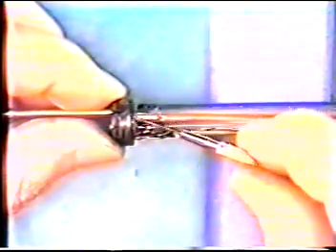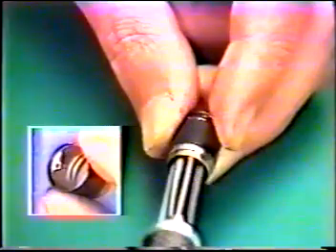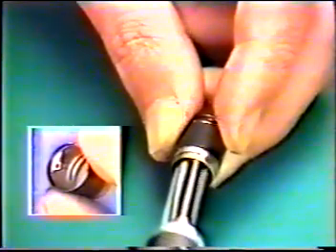Apply sealing compound around the distal end. Insert sleeve. Secure sleeve with 2 screws and apply araldite on the gap between distal end and sleeve.